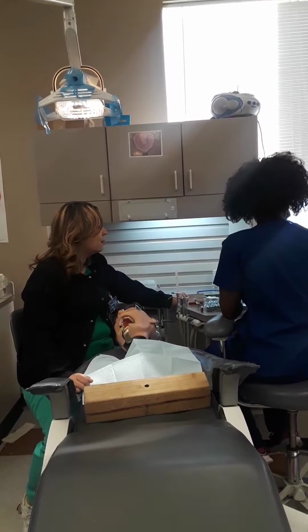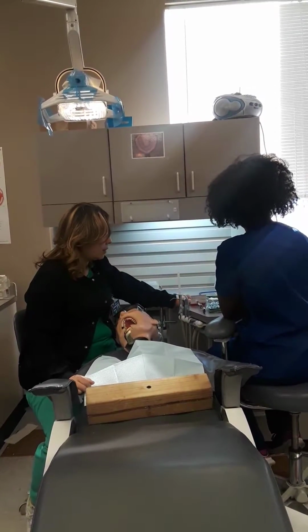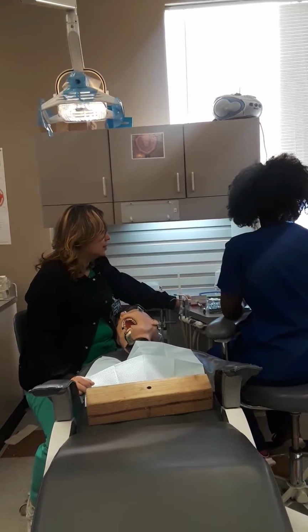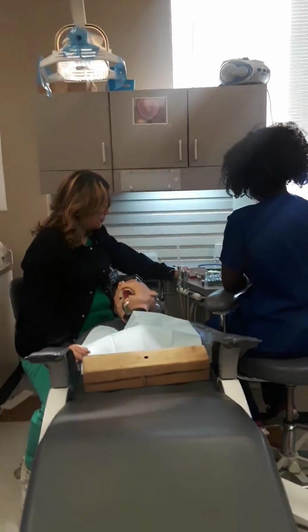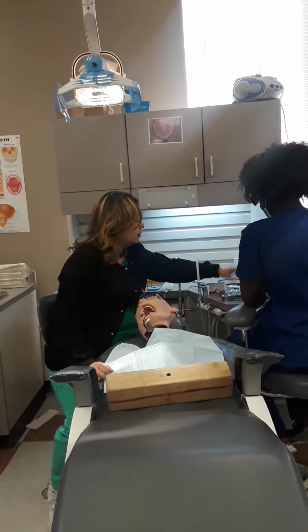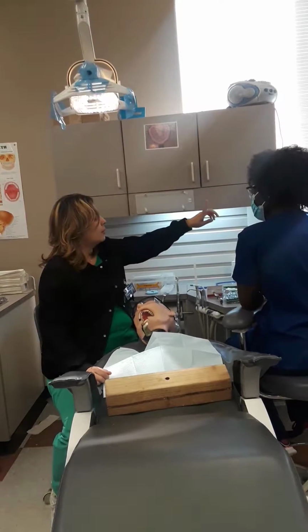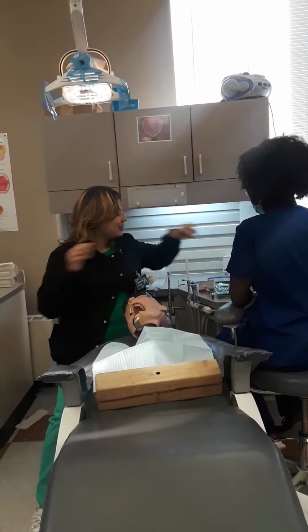Composite gun? Oh, it doesn't say composite? Okay. Compules? Yeah. Composite material. Shade guide. Shade guide, yep. Composite placement instrument. Okay, so let's stop real quick. We're going too fast. Because I got some new students, I keep forgetting.